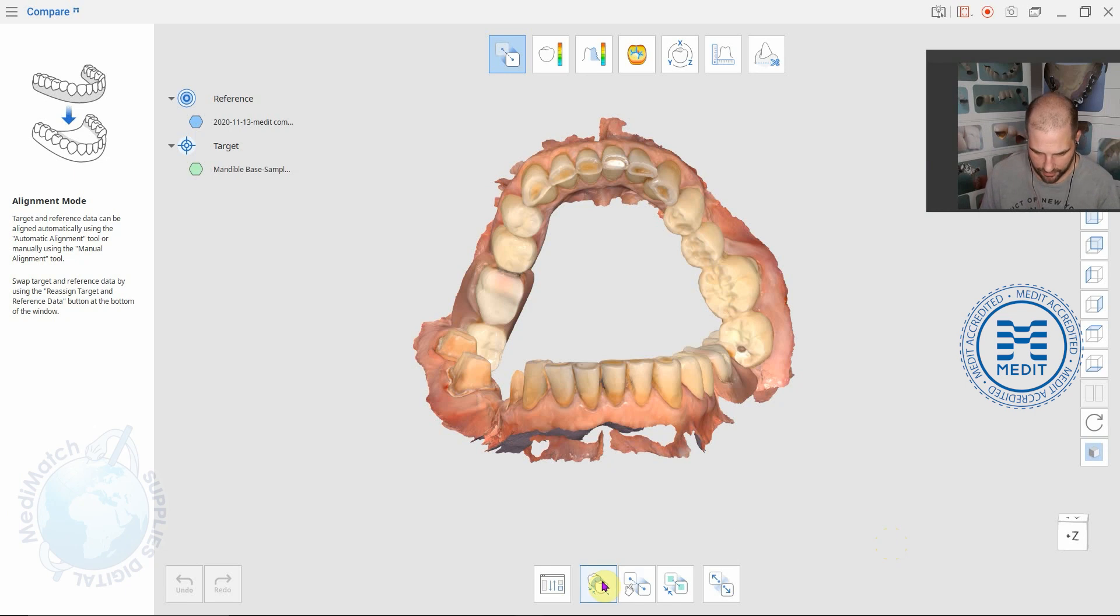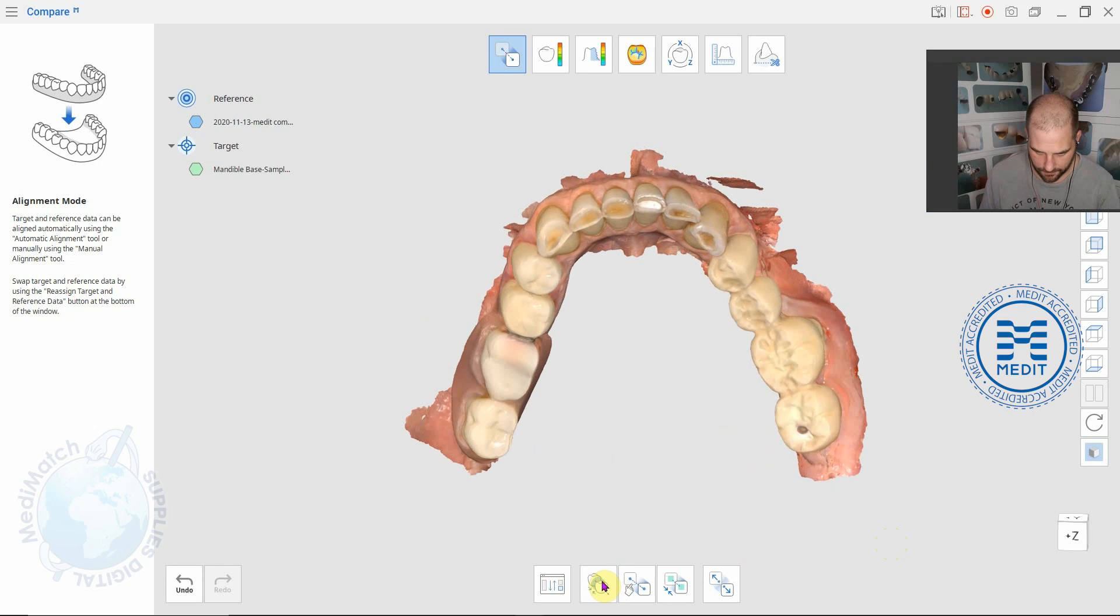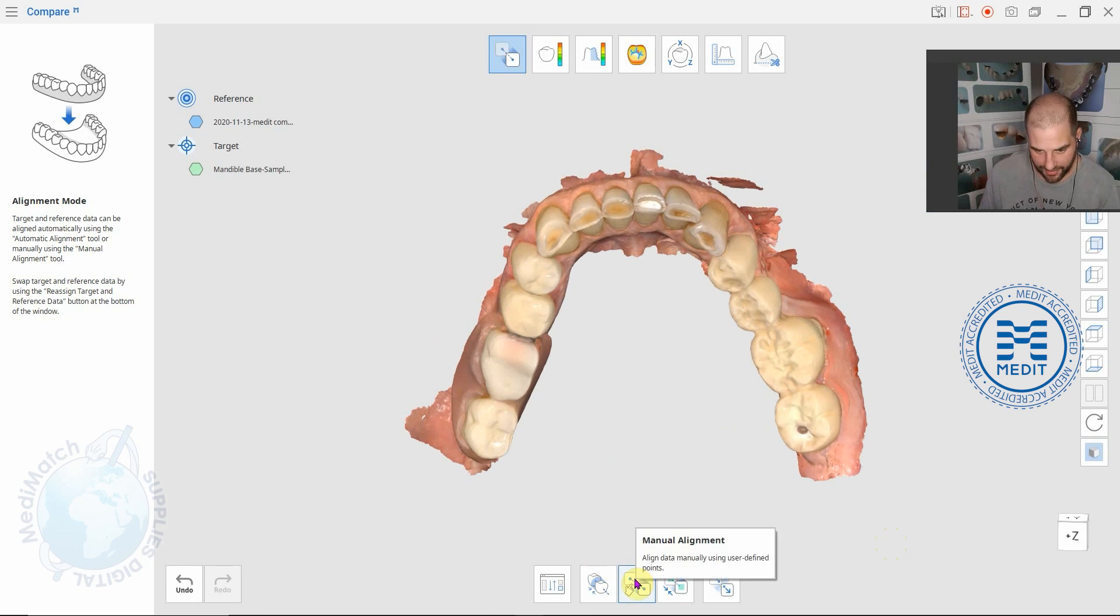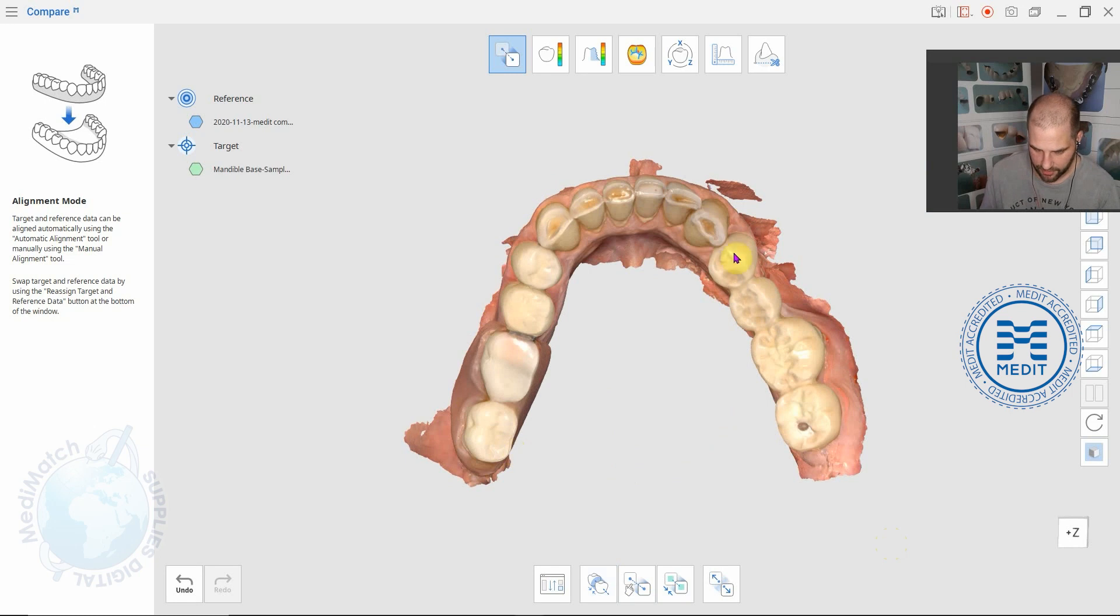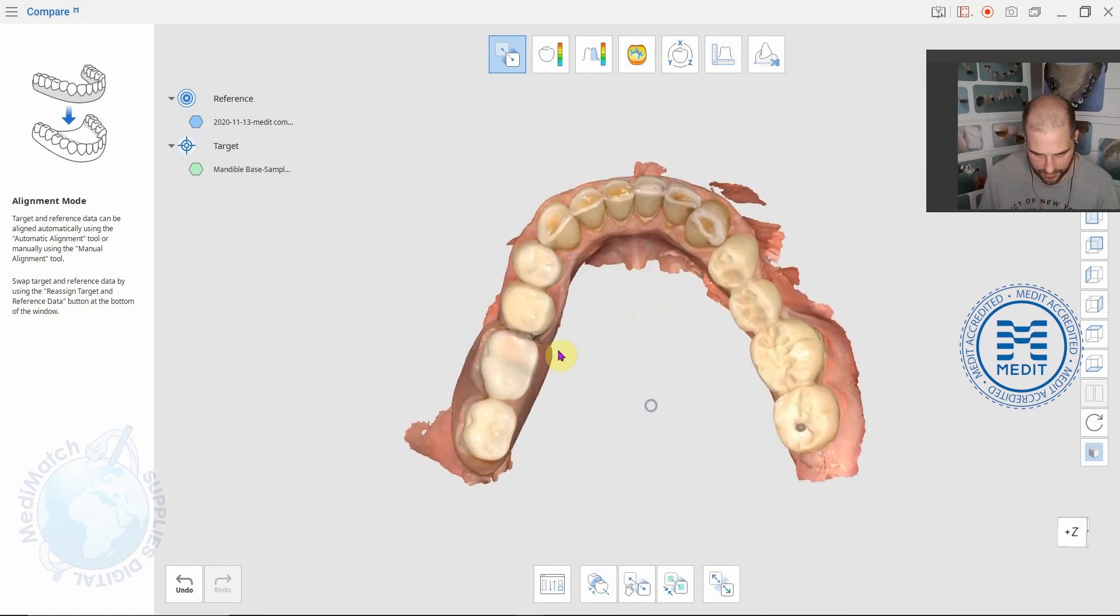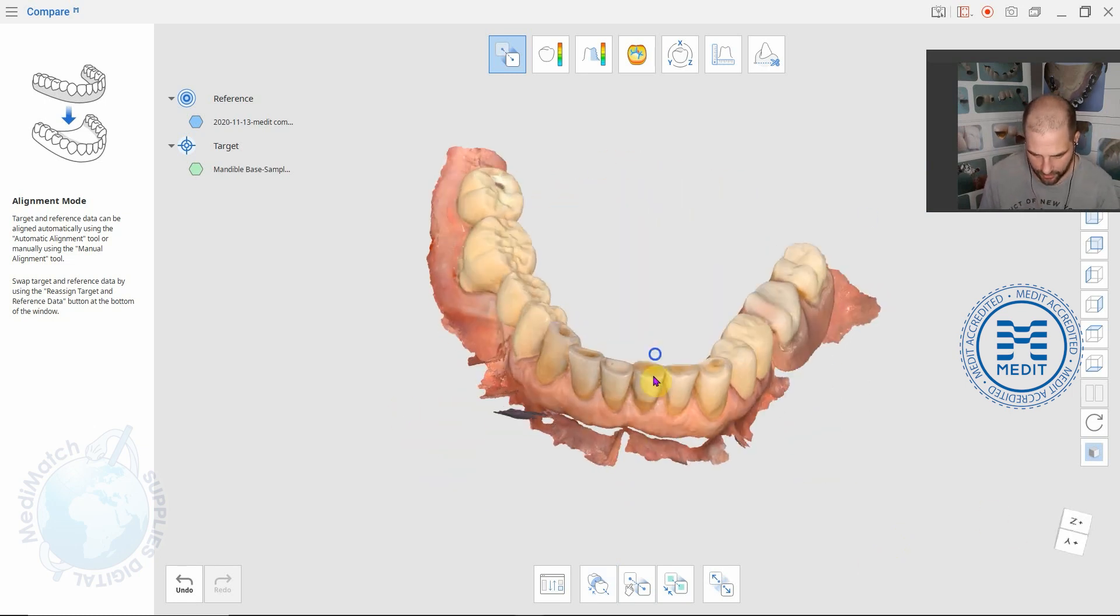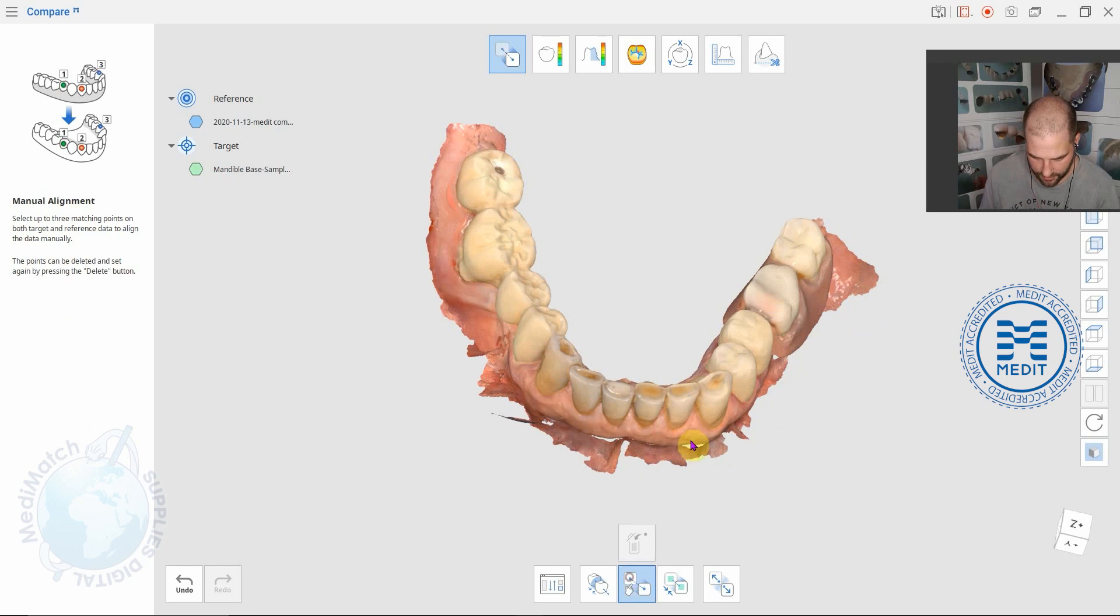We click on this icon here and it will align them automatically. You can use these to manually align them. You can drag them around if it doesn't quite line up as you want or you can click corresponding points. We've got them all lined up one over the other.